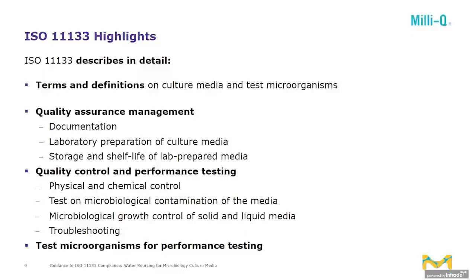The standard 11133 describes in detail the terms and definitions on culture media and their test microorganisms. The whole complex of topics on quality assurance management, including documentation, laboratory preparation of culture media, storage and shelf life of lab prepared media, and of course, the quality control and performance testing, including the physical and chemical control, the test on microbiological contamination of the media, the big topic on microbiological growth control of solid and liquid media, and a section on troubleshooting.